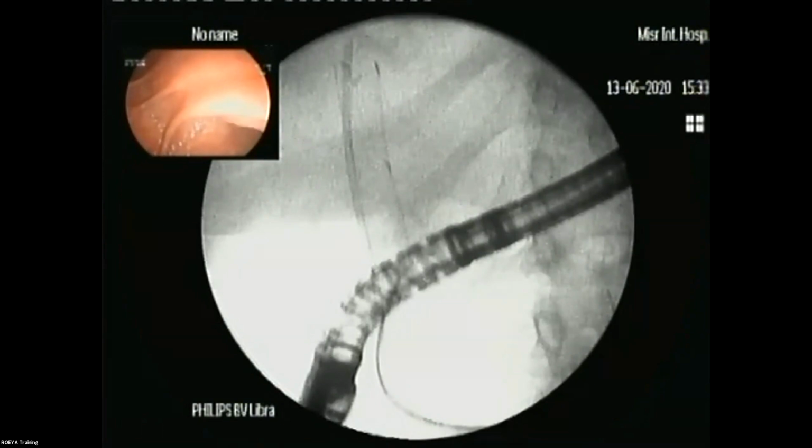Yes, very good now. So what I was saying, the question is, why do we use an intraductal metallic stent? Why not just a conventional metallic stent going outside into the duodenum? The theory is that when the stent is completely inside the duct, there is less risk of migration. It is less exposed to duodenal peristalsis, and it will also reduce the probability of duodenobiliary reflux, and thus you will have less chance of sludge and stone formation inside.